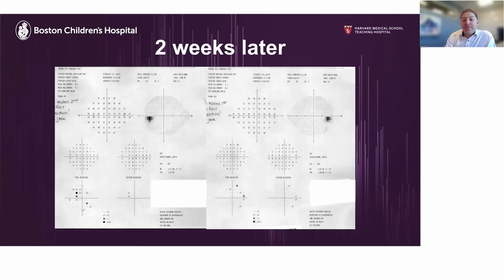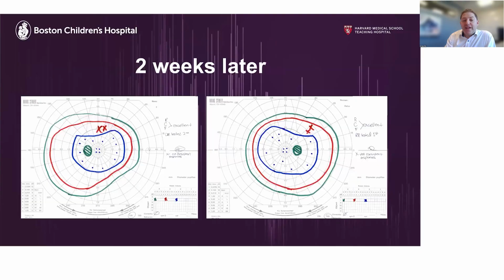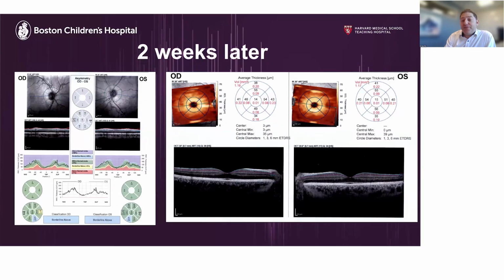Here was his visual field and his Goldmann visual field and his OCTs. So everything looked really, really good. And it was all because we could tell it was going to come back because we had the OCTs from preoperatively.